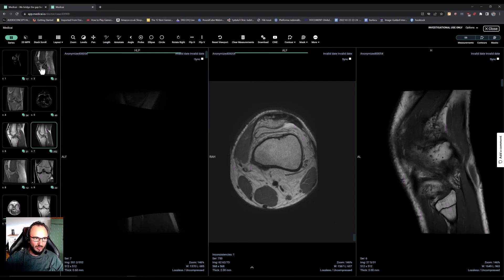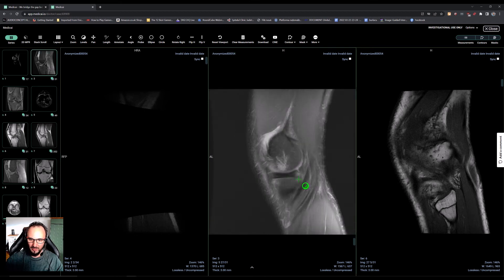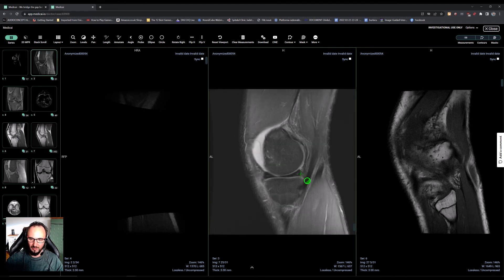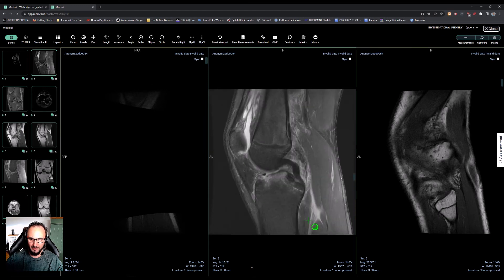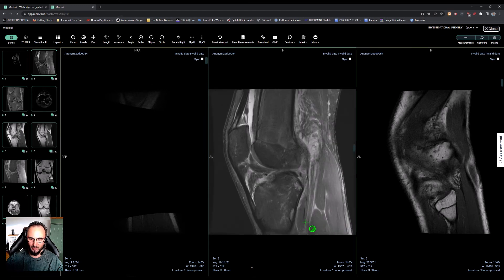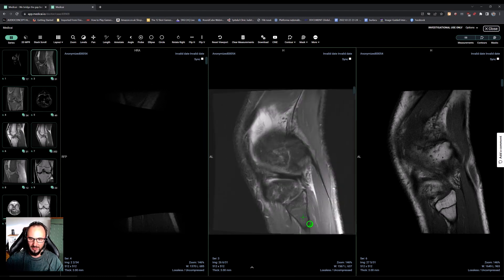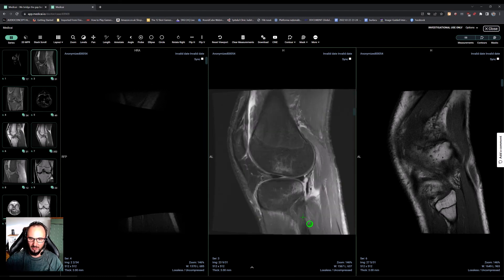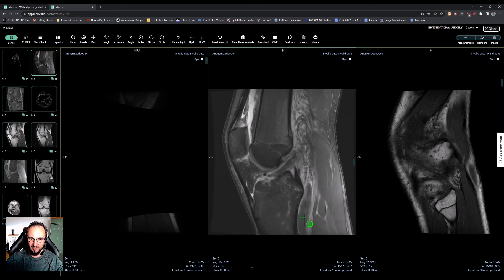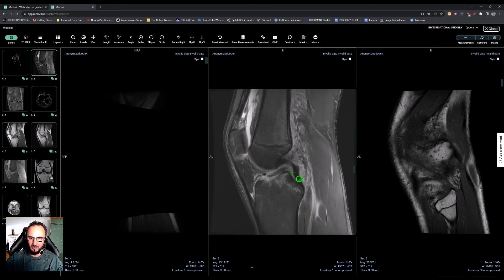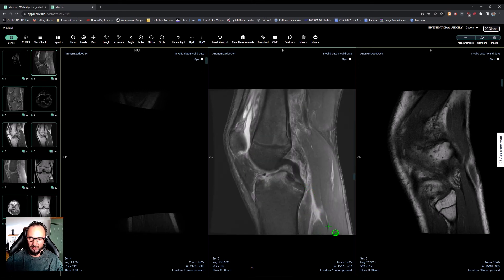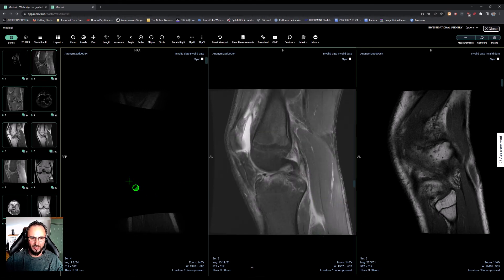As for the other structures: there is a fine line inside the posterior horn of the meniscus, consistent with a grade 2 tear. The external meniscus looks fine, and the posterior cruciate ligament looks fine as well.